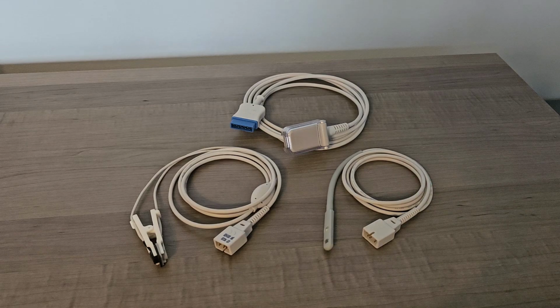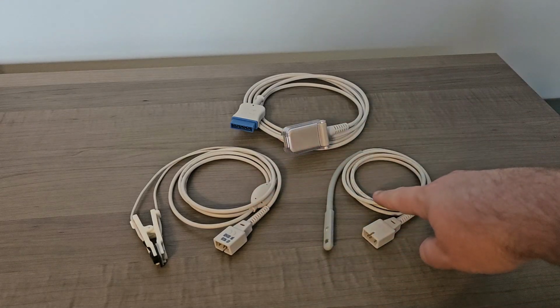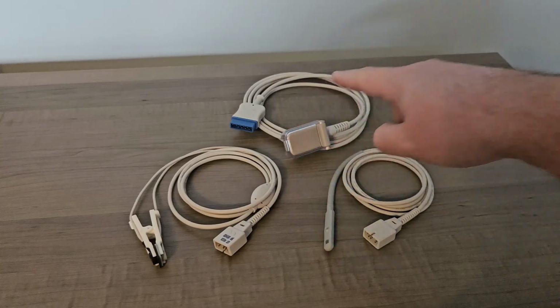While it can be mistaken for a rectal probe, it is designed to be used at the base of the tail. Fur may need to be shaved to achieve proper skin contact. Secure it to the underside of the base of the tail. You may also secure it to the inside of the thigh, the midline of the belly, or the back of the leg just above the pads of the feet. Both of these probes can be plugged into the SpO2 extension cable.